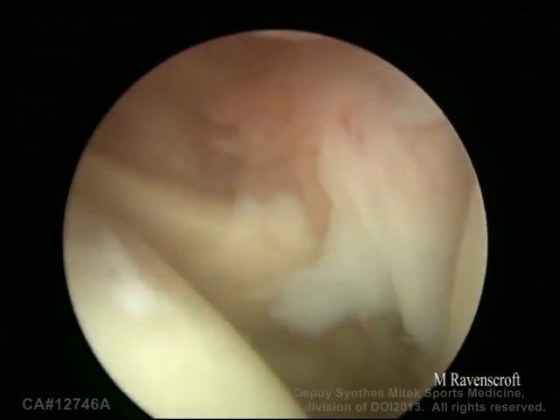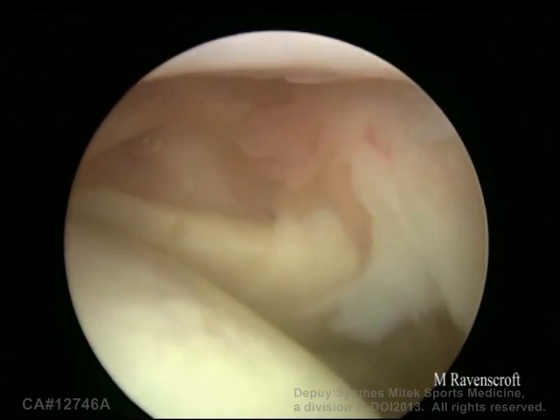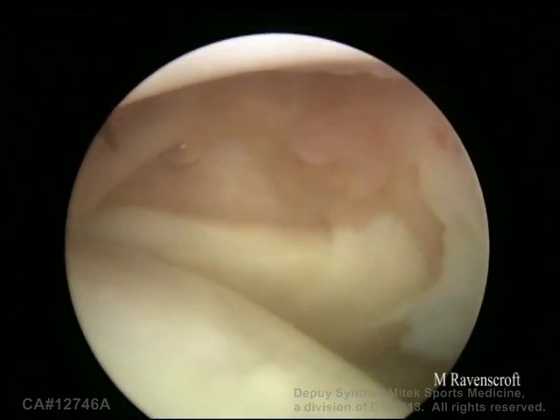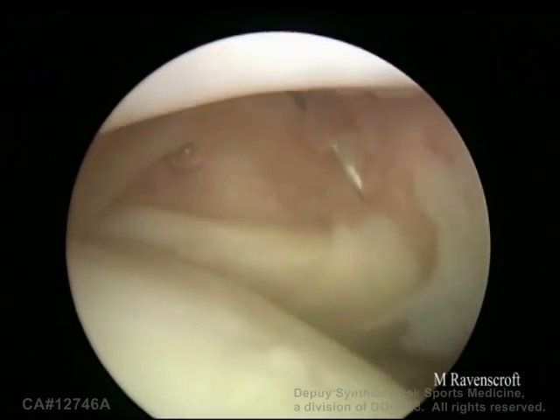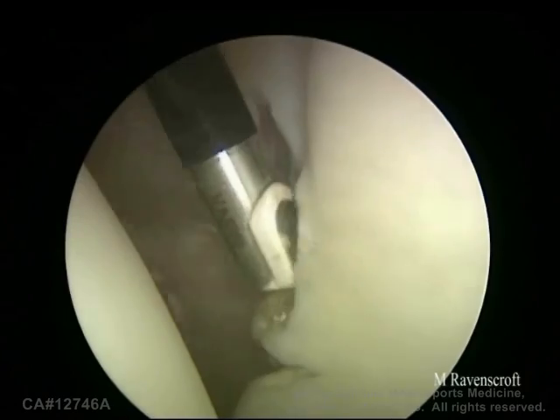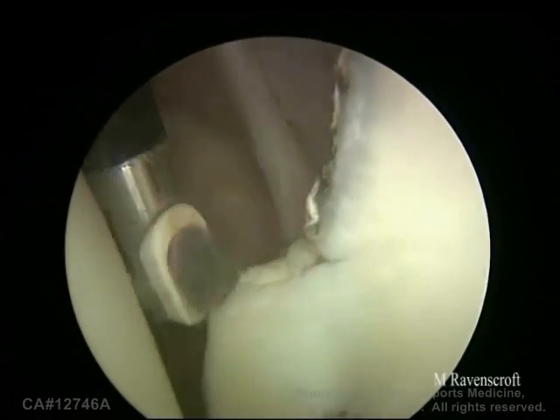Firstly, we need to establish the E portal. This is an out-to-in technique using a needle. Looking in the rotator interval, we want to bring the needle so it's quite high on the rotator interval, so our angle down onto the glenoid neck will be optimal. This is the right position. Through this port we're going to bring in the CoolPulse and do our soft tissue clearance, glenoid neck preparation, and remove the rotator interval and the anterior ligaments.